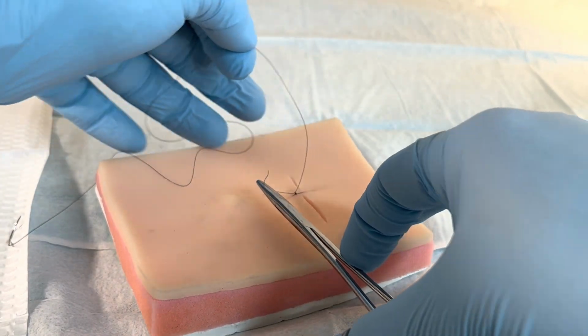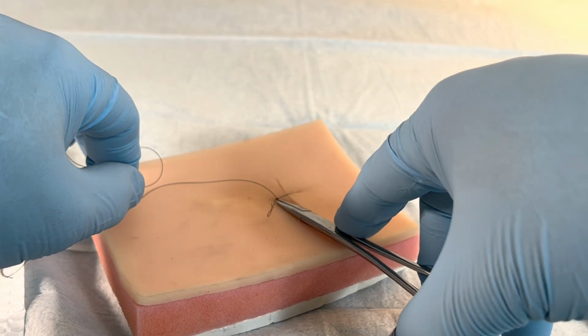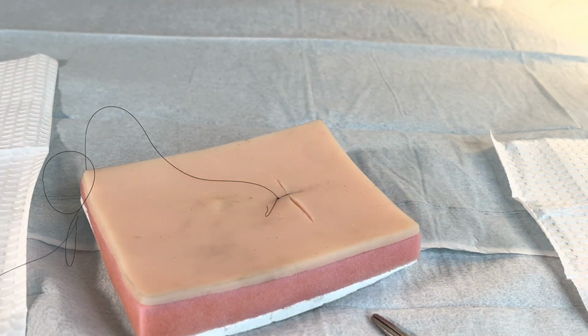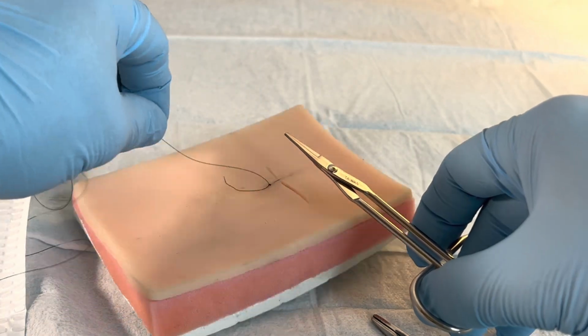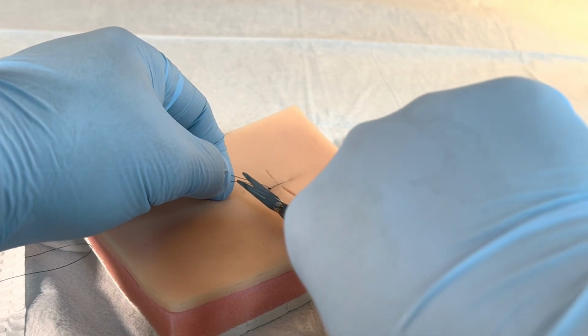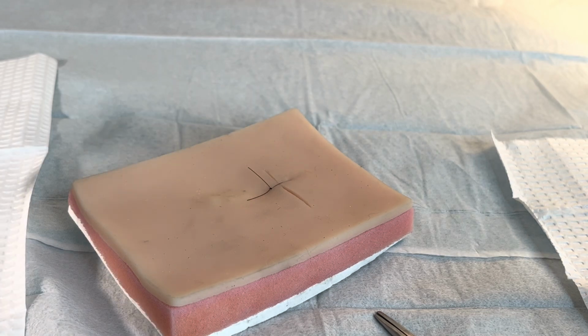And then we would pull the suture over to one side so that the knot is hubbed up against the skin. It's intact, and then with our scissors, we would just grab and snip as you like, leaving a couple centimeters because we want these to be easy to find. And there we have it.